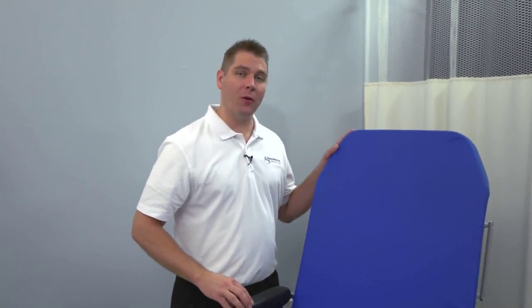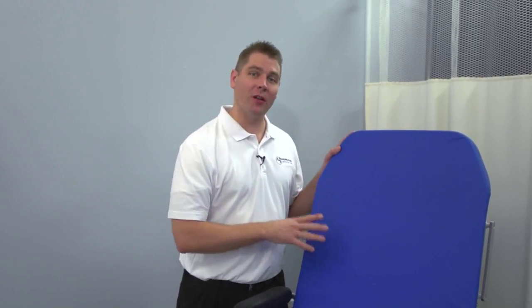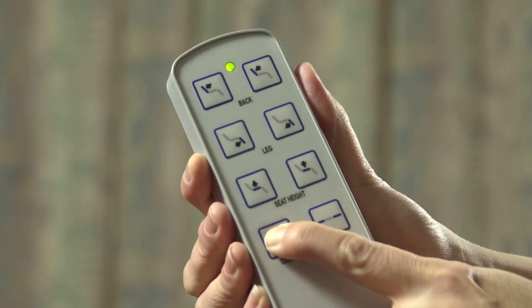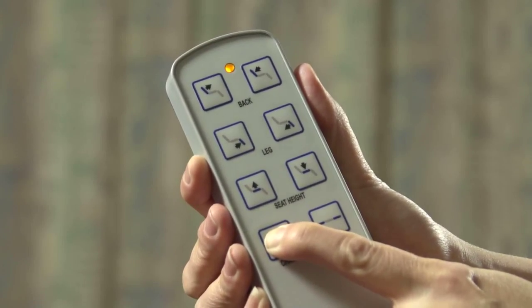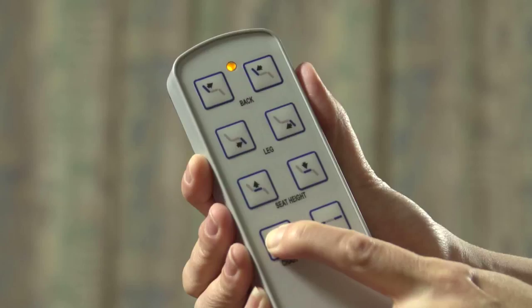Now let's talk about power. The chair comes with two high-capacity batteries and a wall-mount charger, so while one battery is on the chair, the other is charging. This provides continuous power for the chair when needed. The pendant light will change color from green to amber, indicating the battery has approximately 25% capacity remaining.